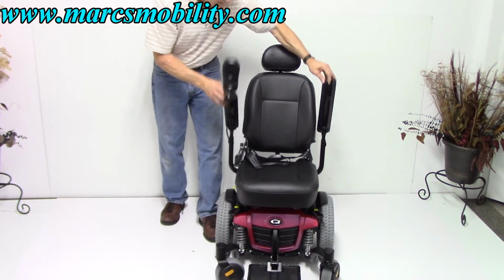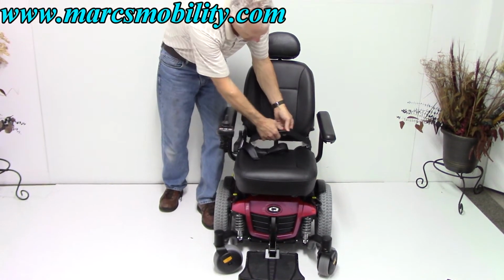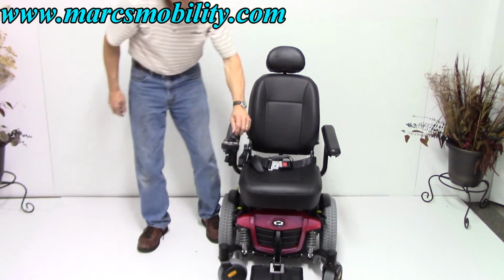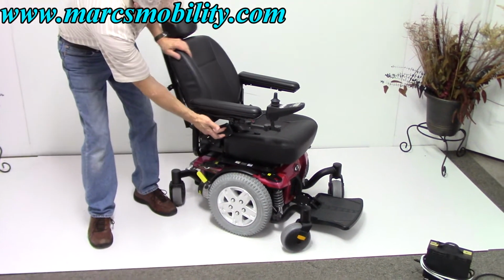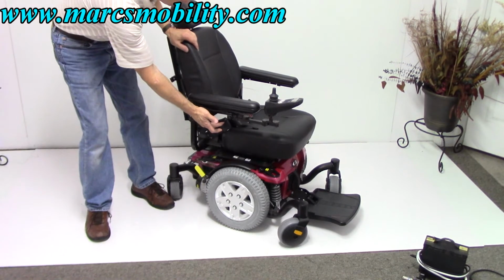The arms do move up. You have a safety belt. You have an adjustable seat. You can see the handle here. If I move the handle up, I can adjust the seat.